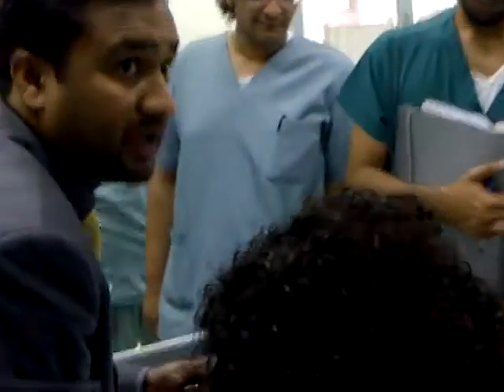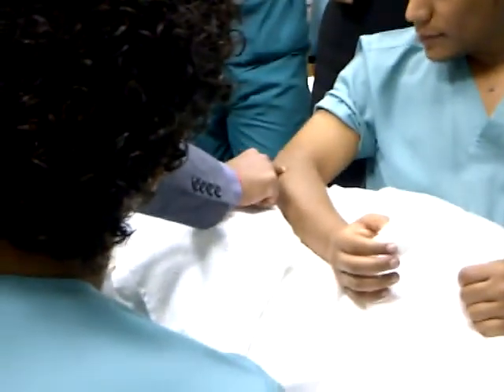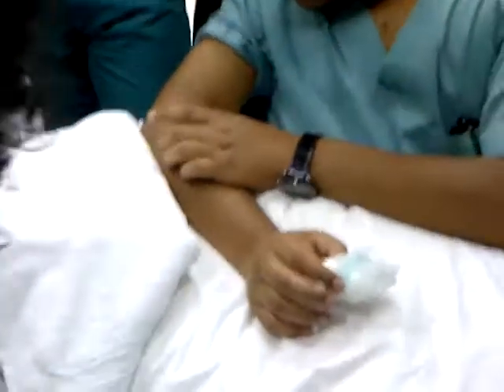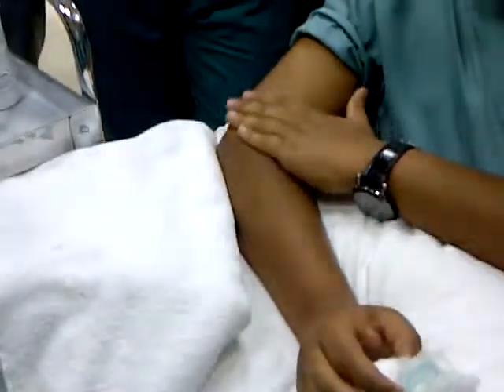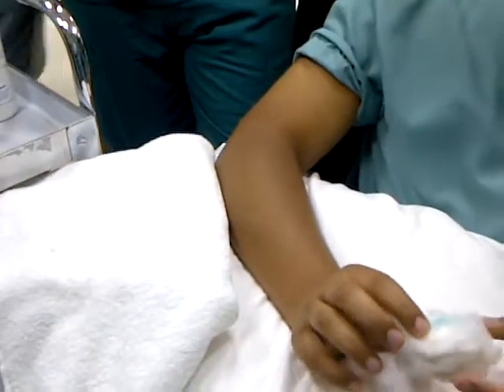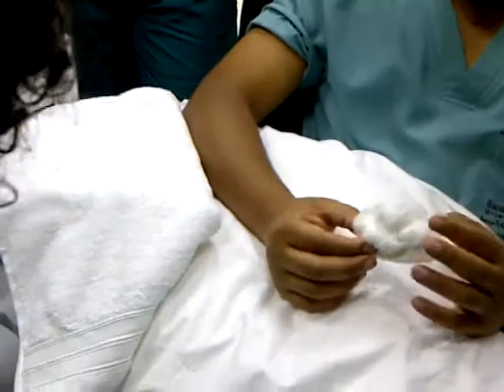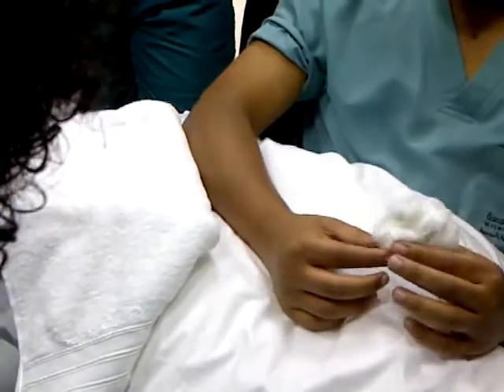After treatment of 10 or 15 minutes, whatever it is, if you see the area, you may see some redness. Why? Because of heat. So what are the benefits of heat? Increased vasodilation, increased blood supply, nutrition, oxygen, all these things. So increased extensibility, collagen, fibroblast production, everything. All the benefits of ultrasound are going to be there.